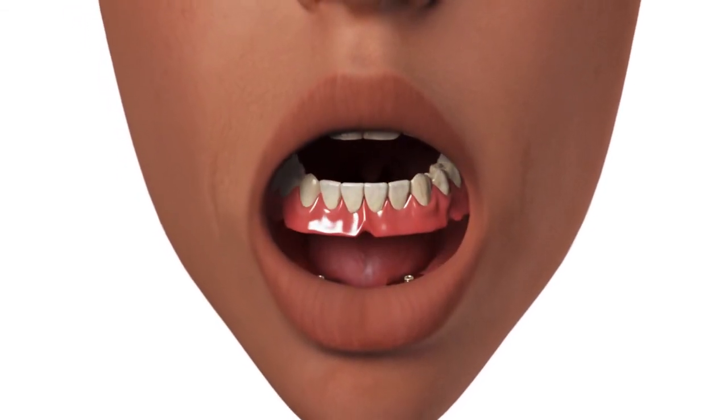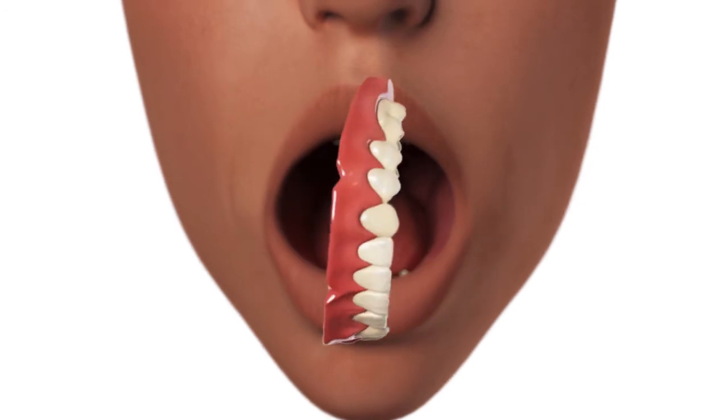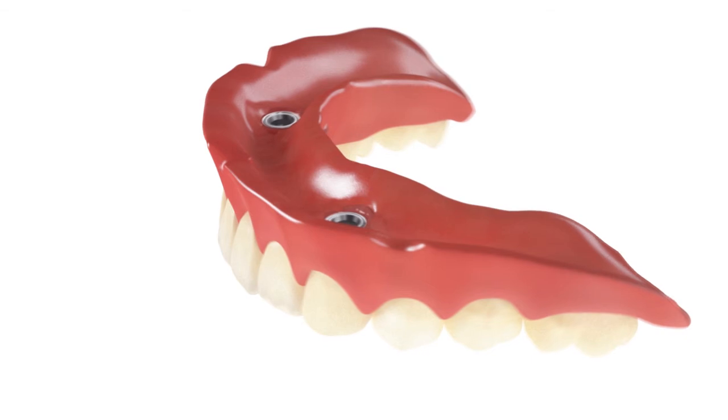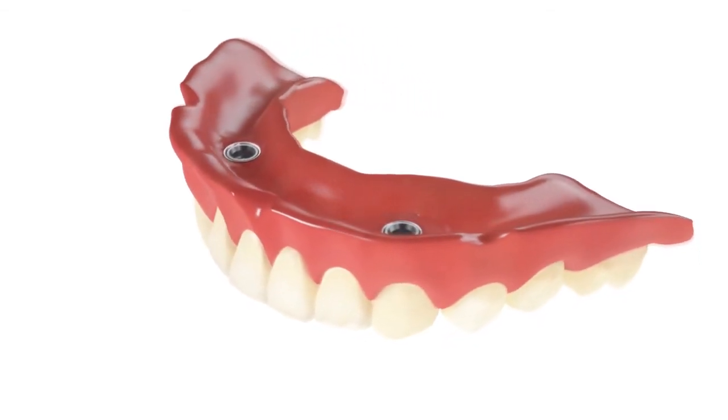After the acrylic has cured, remove the denture. Fill in any voids and remove excess acrylic around the housing cap and the lingual vent holes.